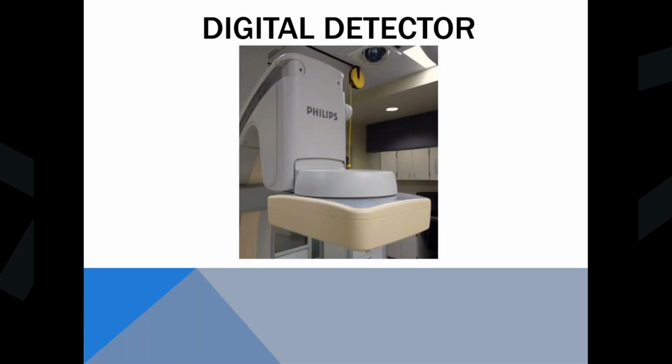And then the next step up from that was your digital detectors. These all started coming out in the early 2000s, so they've been around for about 25 years. This one here is probably about 15-year-old technology. It still works the same as the newer ones, it just didn't have the resolution and the speed that the new ones do.